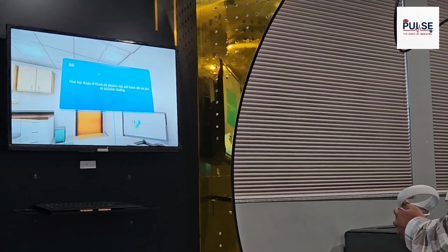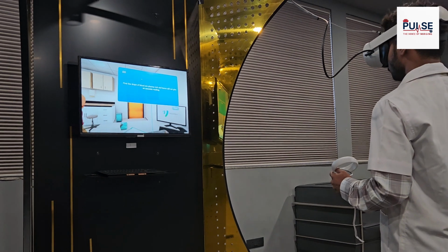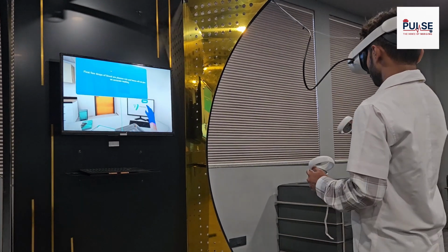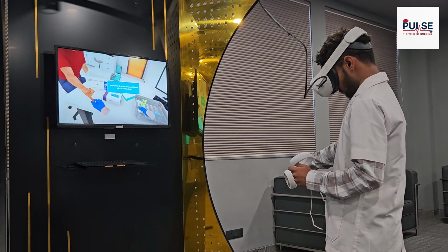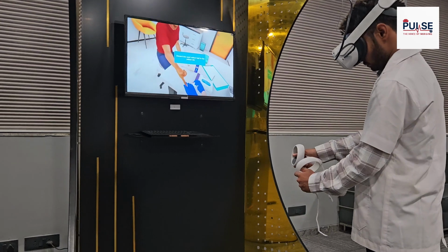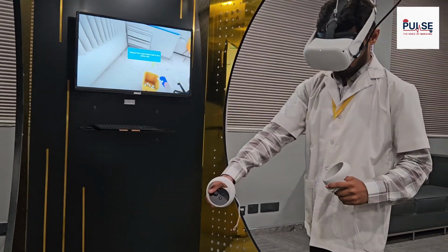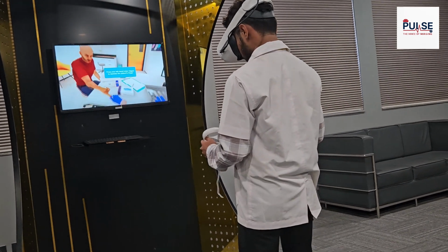The first few drops of blood may contain plasma and hence will not give an accurate reading. Wipe the first few drops of blood with a cotton ball. Discard the used cotton ball in the yellow bin. Press your left hand index trigger to squeeze the patient's finger.